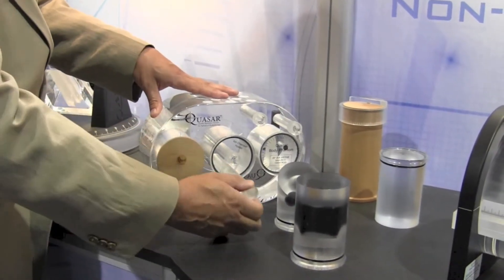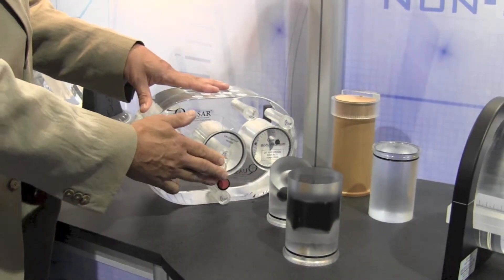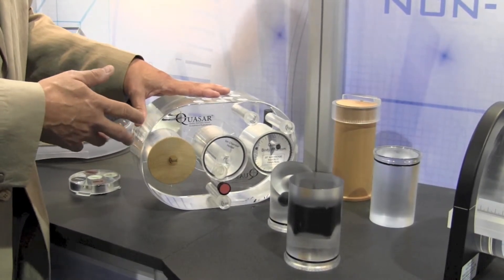There are other inserts for ion chamber dosimetry. We can also do film dosimetry, and so this is a very flexible phantom that can do many different types of QA on planning systems and delivery.